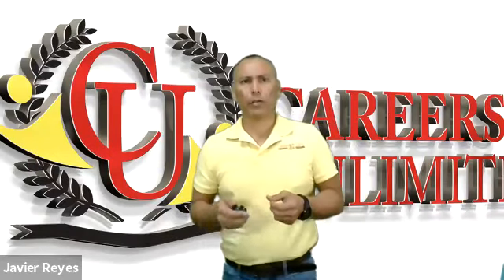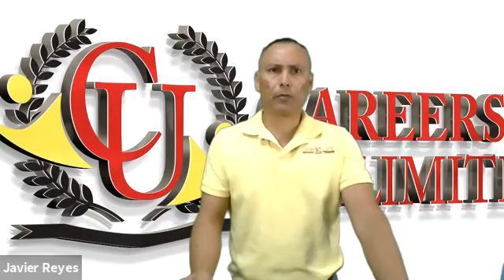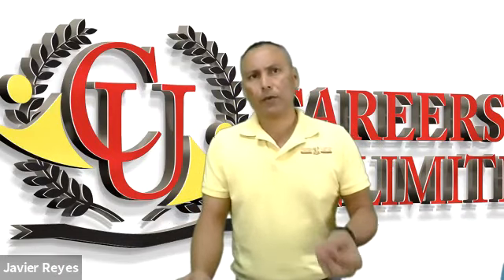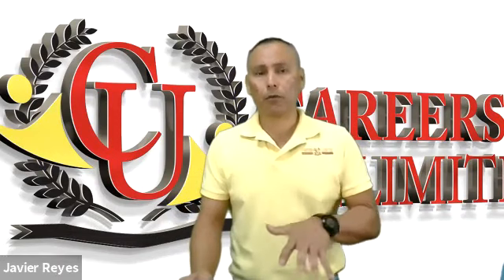All right, so we continue our conversation here on pre-analytical errors, and we're going to look at some of the problems that we're going to encounter with the actual sites that we're going to be selecting. I know it's very easy sometimes to go for the first vein that you see, but you have to consider other things that may affect your results.